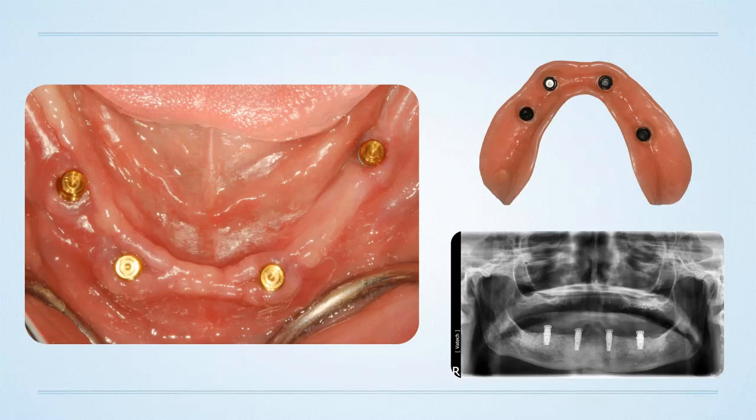Like I said, make sure you've got a cone beam for these cases. Anytime I do implant surgery, it's with a cone beam. However, it's really important if you're going posterior to the foramen, meaning in the posterior mandible. And then also with using creative 3D printing, you can make your own surgical guides for $20, $30. So that really drives your cost down. And then using an implant that costs $200, $210 as opposed to $400, $500, you can do this on a regular basis in your clinical practice.